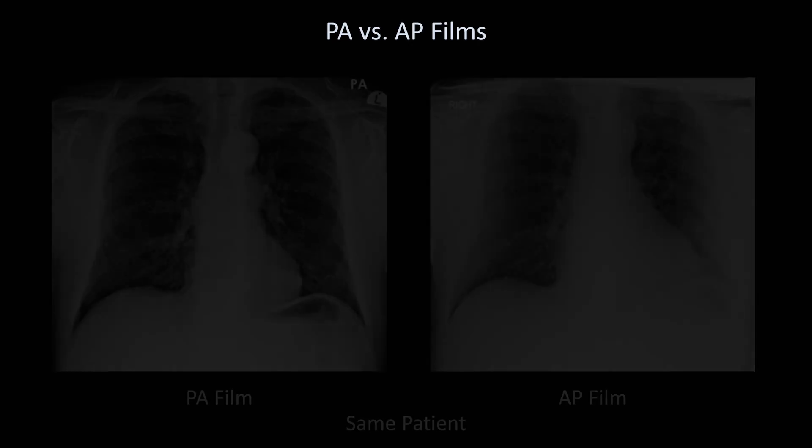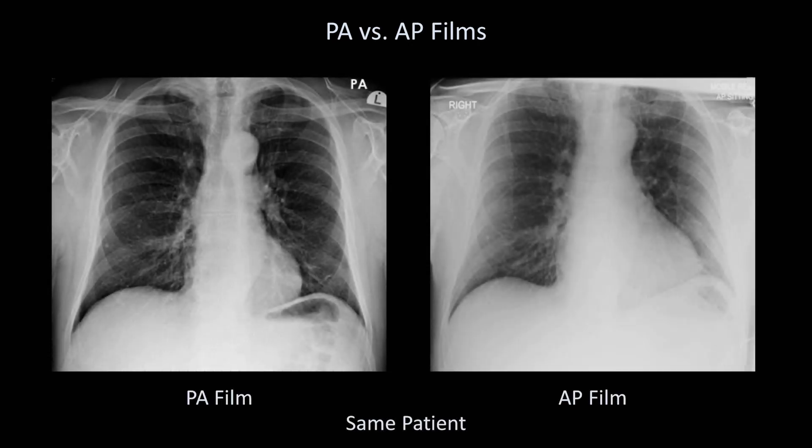To see just how much of a difference this can make, here are two x-rays taken of the same patient minutes apart. Notice how much larger the heart appears on the AP film. The upper mediastinum is also affected, but not as much.